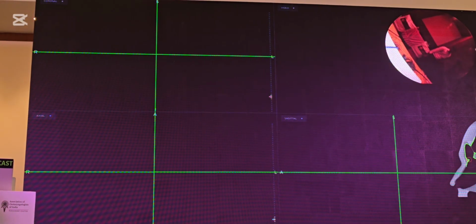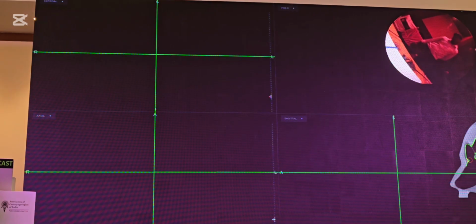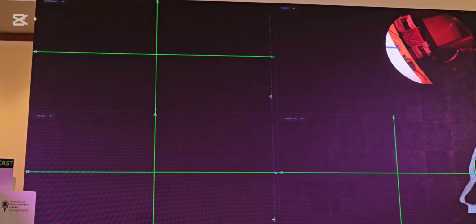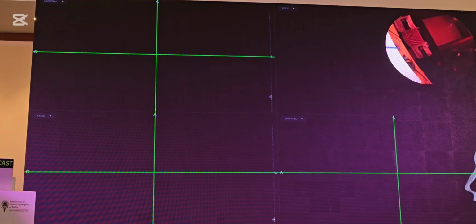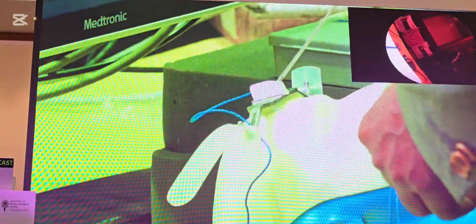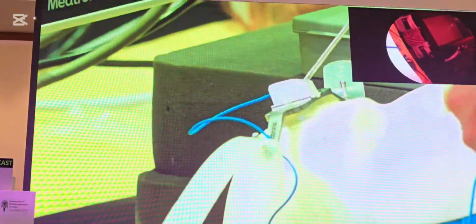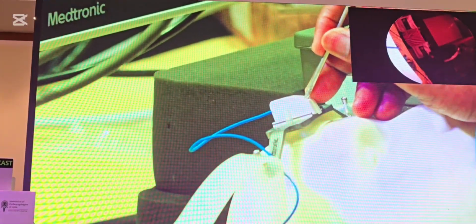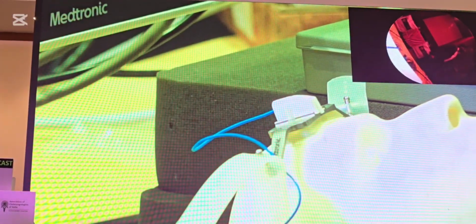Put under the external camera. External camera. Yes, yes, okay. So when you place it here, this instrument will be registered as straight suction.